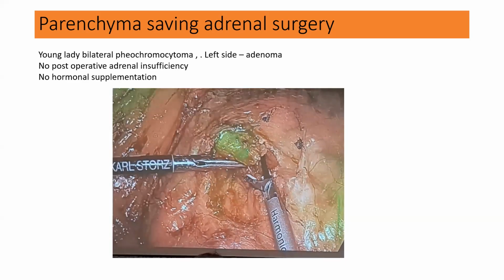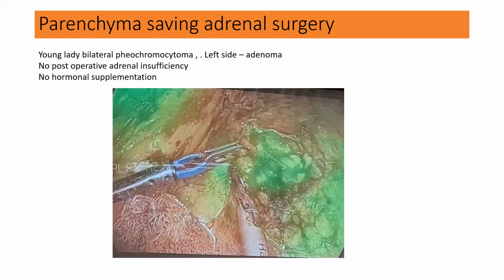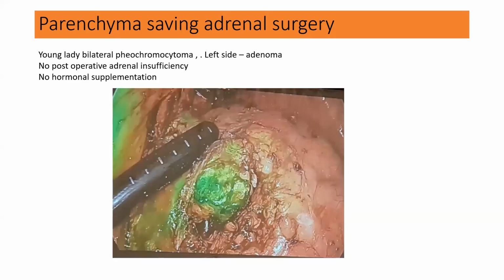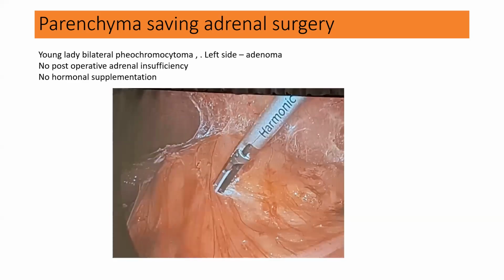So we wanted to save the rest of the gland. We only wanted to remove the adenoma. So that is how it could be done with the help of ICG. That is parenchyma saving adrenal surgery. So that particular adenoma was removed.